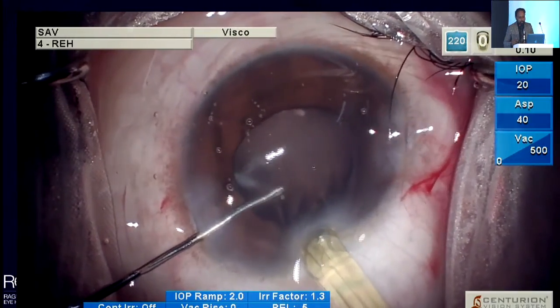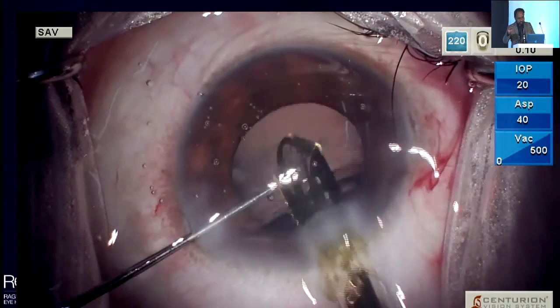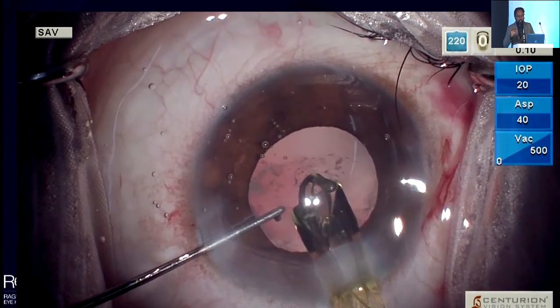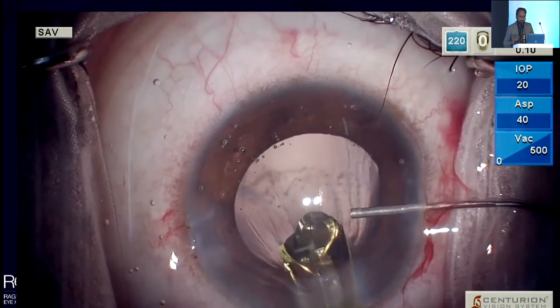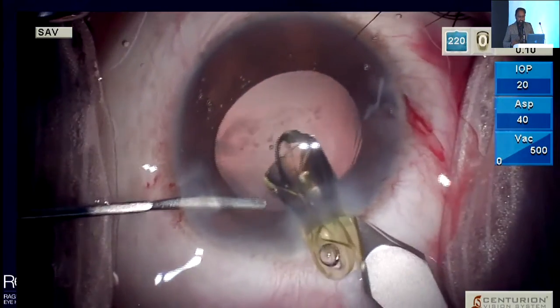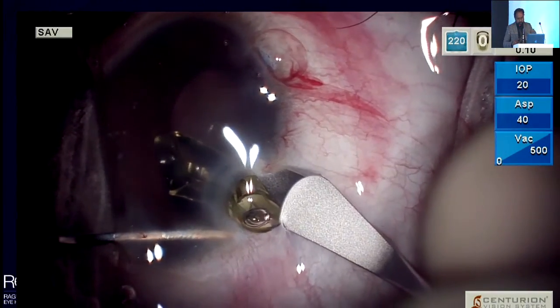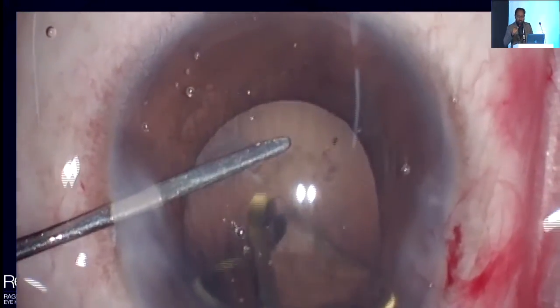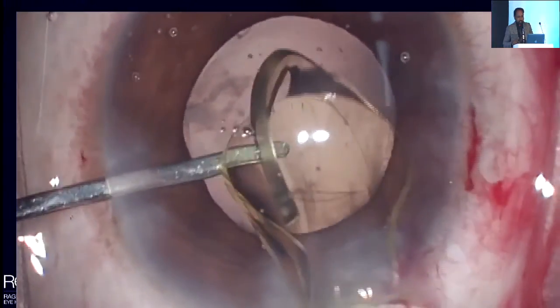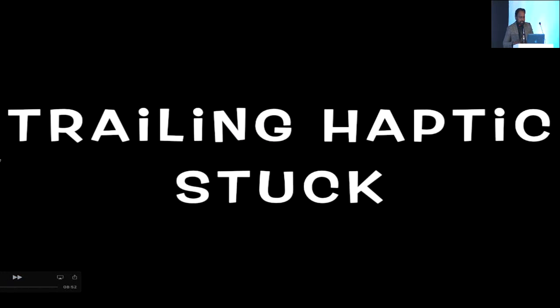So the other method of what can happen when your lenses get stuck. Sometimes you can see that overriding of the rider. So that's when it's not pushing and the lens is stuck. The other method you can do is use your keratome and give a mild nick at the edge of the wound, because sometimes it's very difficult even with your forceful thing to push these lenses, and there are instances where it has caused a rupture. So just a mild nick and then you have some space and you can maneuver these lenses and push them inside.